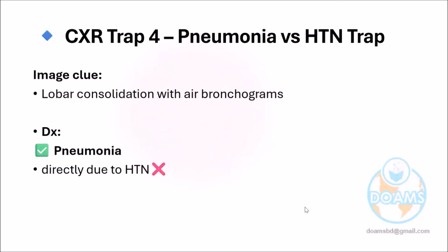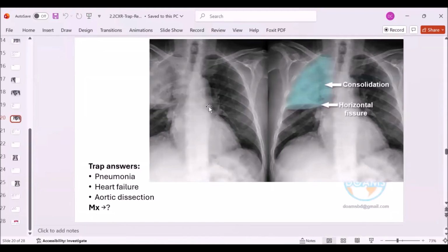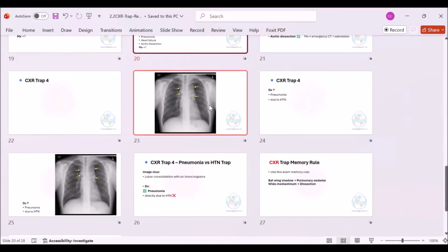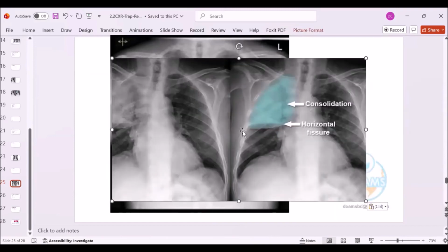Possibly this slide correction should be there. Dr. Javed, can I take 1 minute? You should not be confused. I think these X-rays are better placed here. Pneumonia X-ray is here. Right, Dr. Javed, please guide me if I am wrong.